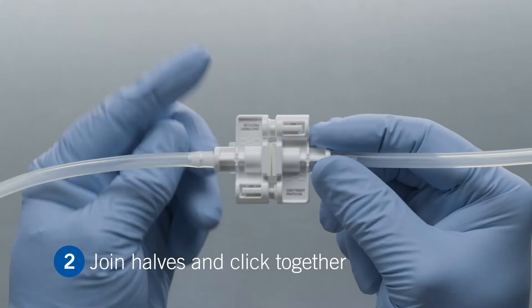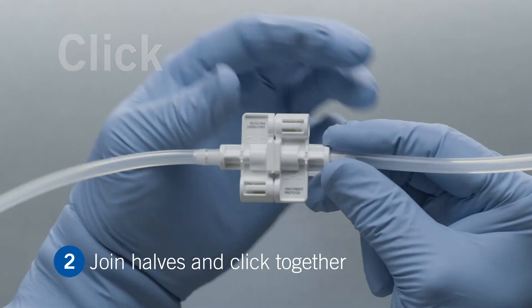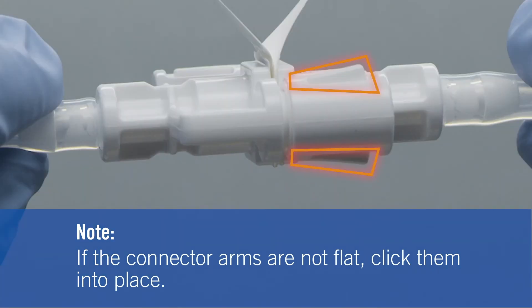Next, join the connectors together and click into place. If the connector arms are not flat, click them into place.